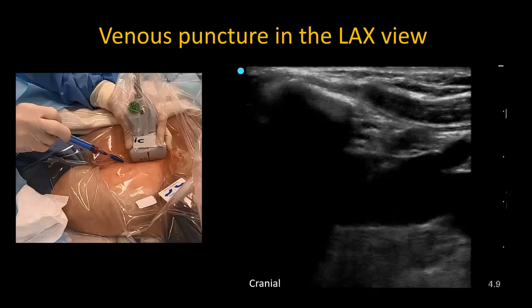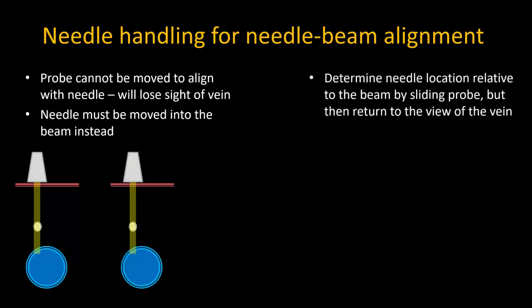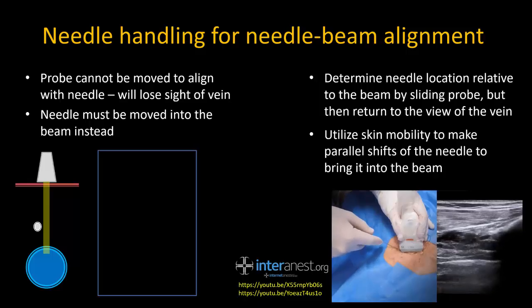Entry will be confirmed by aspiration of blood. If you do not initially have good needle-beam alignment — which is quite a common occurrence — you can slide your probe laterally or medially to find the needle. At that point you will lose the view of your target, the vein, but you will know whether your needle is lateral or medial to it. Slide the probe back to find the vein, then shift the needle trajectory in the appropriate direction to bring it in line with the beam. The mobility in actual patient skin will usually allow you to make a parallel shift of the needle. This is much better than angling the needle to enter the vein from one side, which increases the risk of through-and-through puncture or difficulty threading the wire.